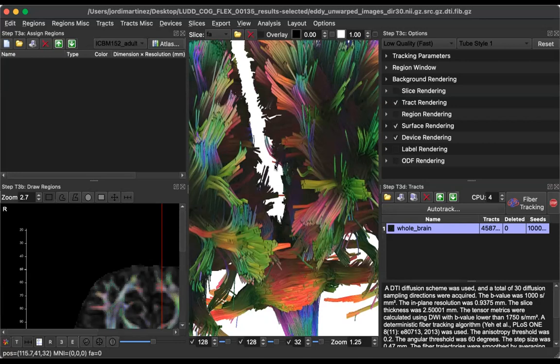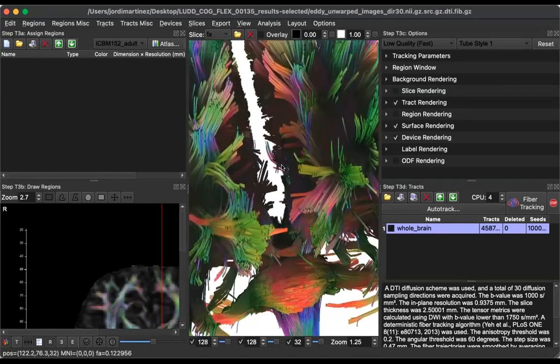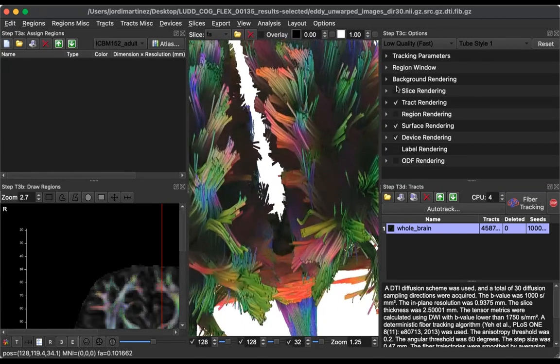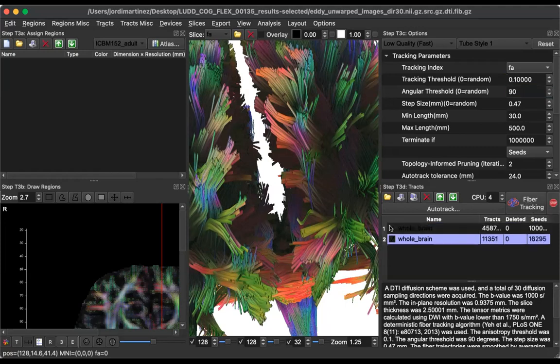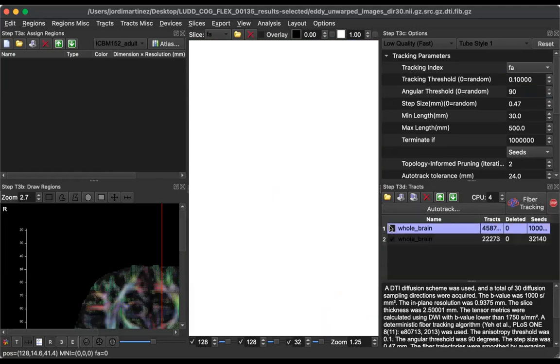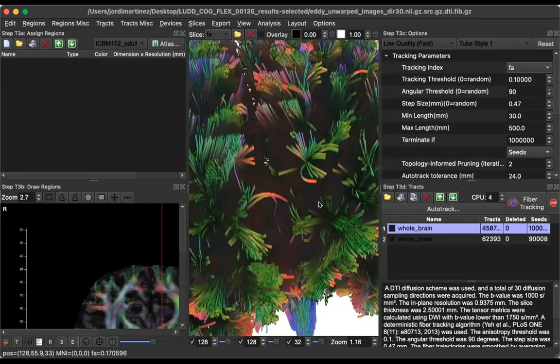Oh, okay, that's cool. You got one fiber? This is the grade. It doesn't seem to be anything there, nothing. I wonder if I put the FA lower. So they don't have an anterior commissure either? Oh, we don't know. I thought that was an agenesis finding. They do still have it. Yeah, look at that.